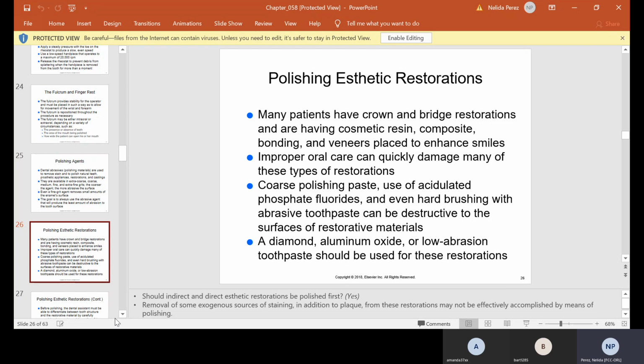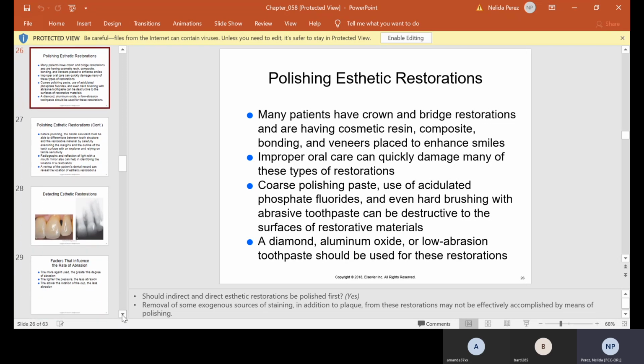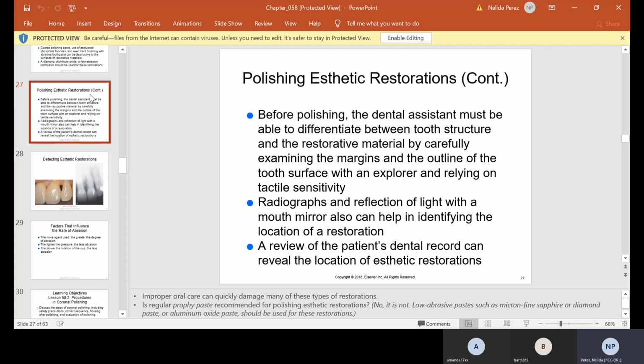So again, we have different types of paste for pretty much everything. So we have a paste that looks just like toothpaste, and that would be used for anybody that has any types of crown or bridges.